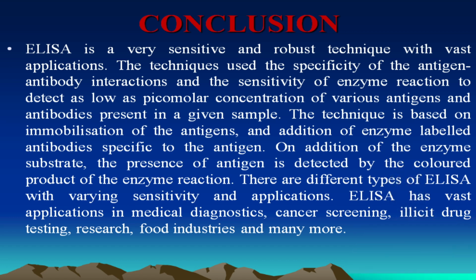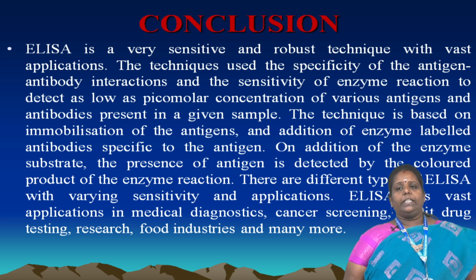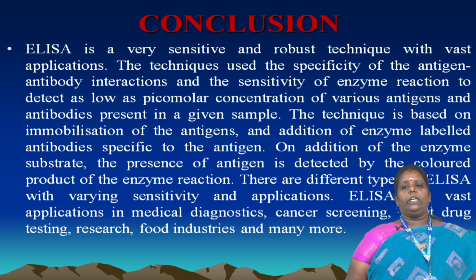ELISA is used in diagnosis in the medical field. Cancer screening is also very important, and drug identification and drug testing are also very important. Many research studies use the ELISA test, and food industries and many more industries also use it for identification.